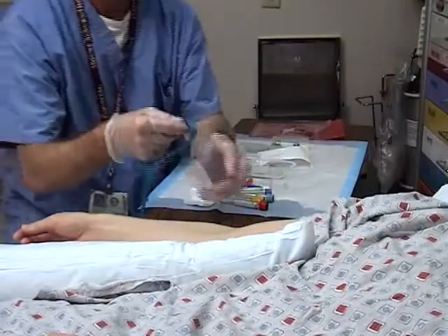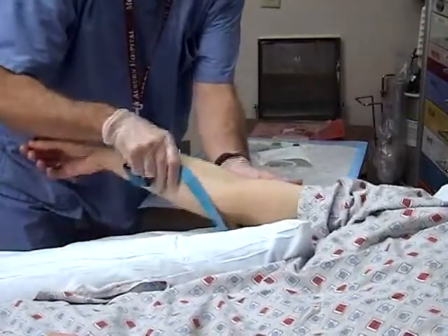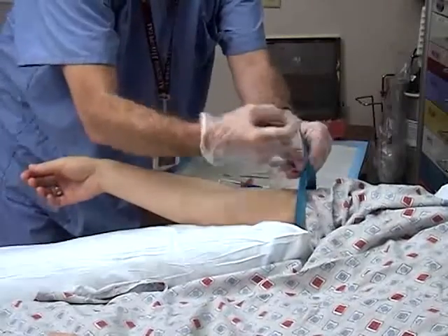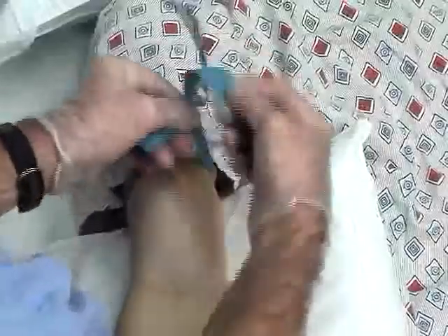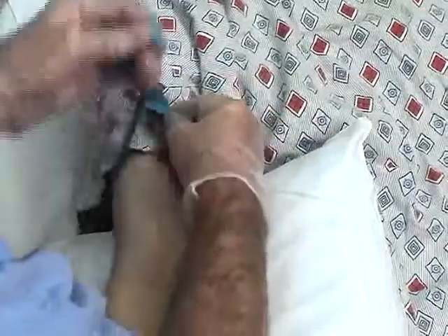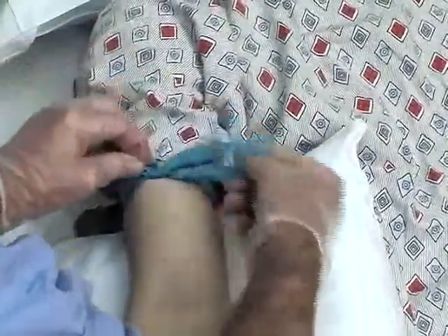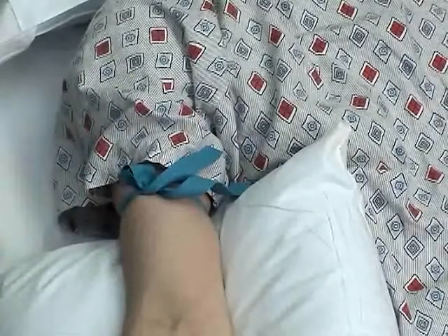Place a tourniquet 5 to 10 cm proximal to the anticipated cannulation site. Wrap the tourniquet around the arm and then tuck a loop of one end of the tourniquet under the other. The tail of the loop should be proximal enough to keep it out of the venipuncture site.